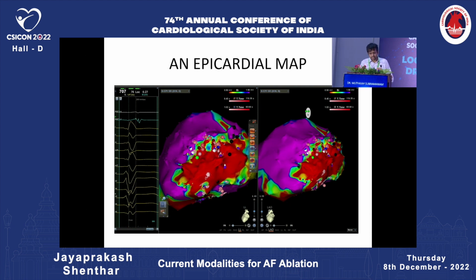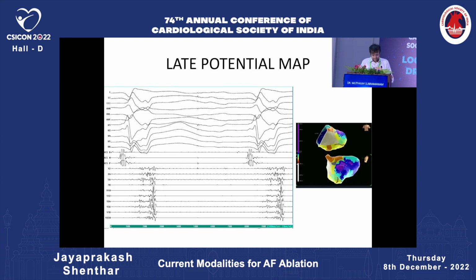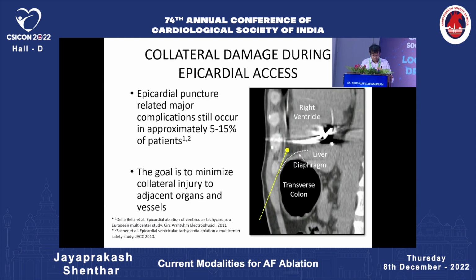So, depending on the initial patient I showed you with hypertrophic cardiomyopathy, scar may be slightly in unexpected areas, and I'll show you what I mean. This is just showing late potentials that are recorded in the epicardium, and the mapping techniques per se are similar to the endocardium.